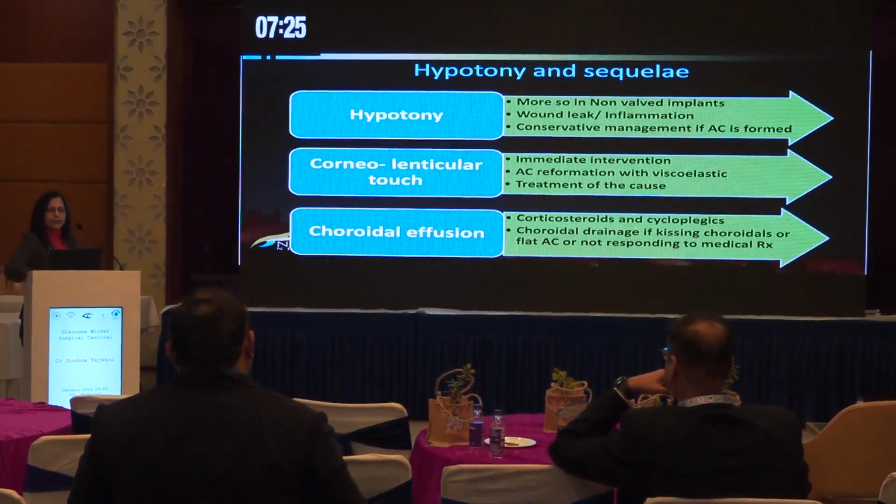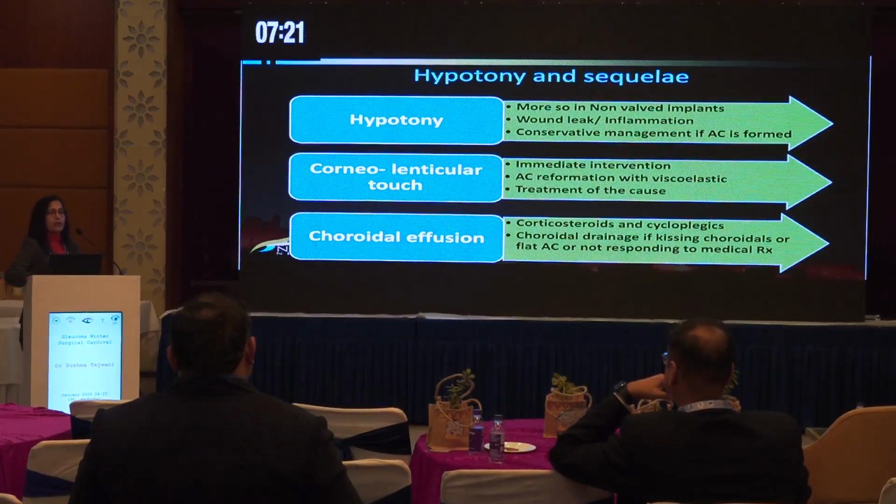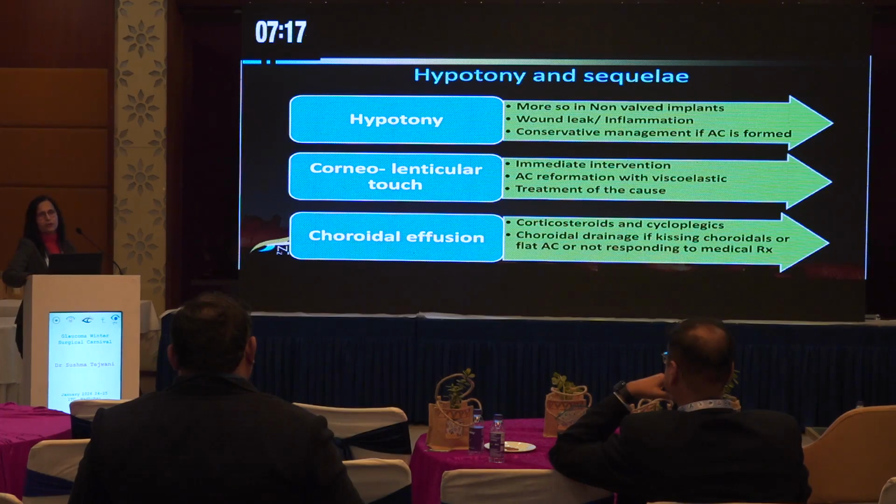So how do we deal with them? We have seen how it is more with implants which are non-valved, and how you manage them. You put a tight suture to close the tube, and then follow up the patient properly to see when the ripcord or the suture is opening, and how to manage the hypotony.